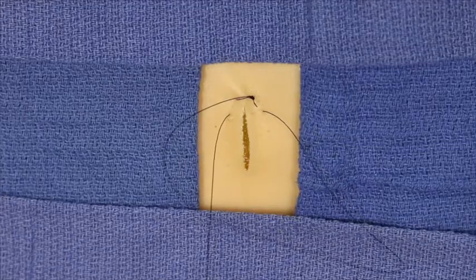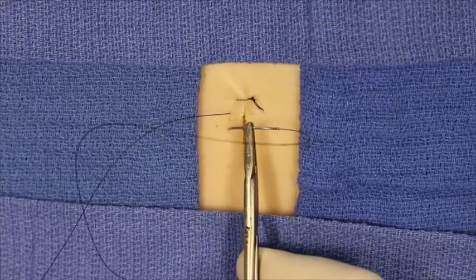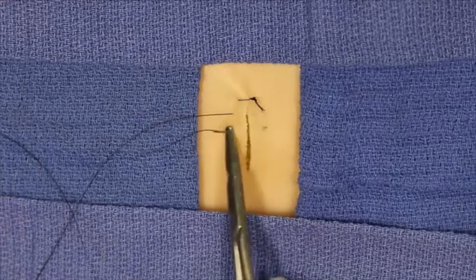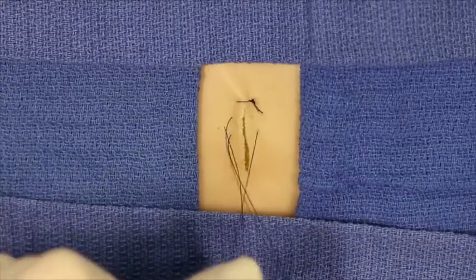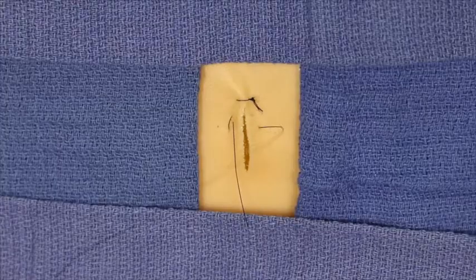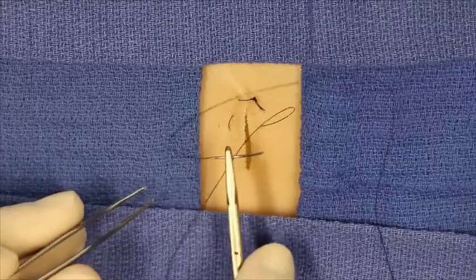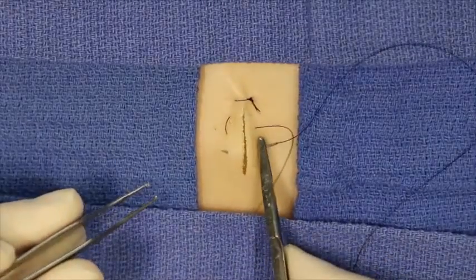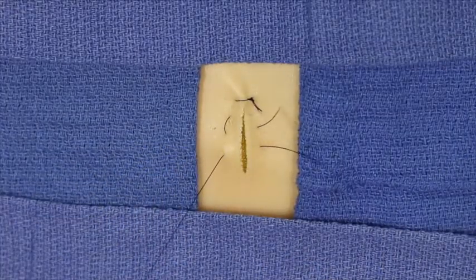The needle is reloaded in a backhand fashion, exiting and now entering on the same side, traversing across the incised wound edge. Reloaded now in a forehand fashion, the needle enters proximal relative to the surgeon from where it entered but on the ipsilateral side, passing across the wound.